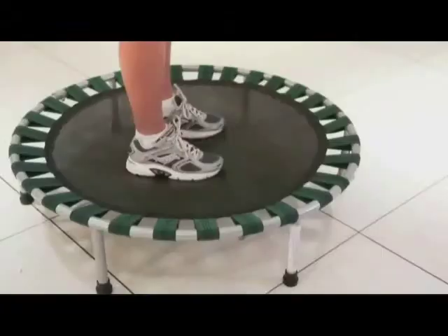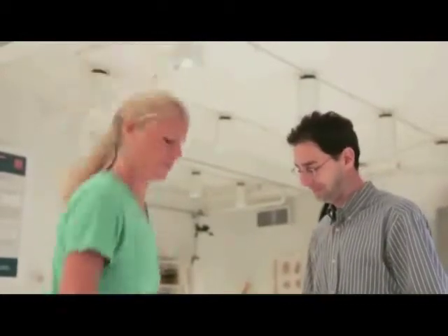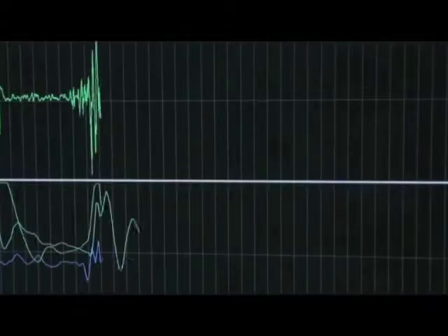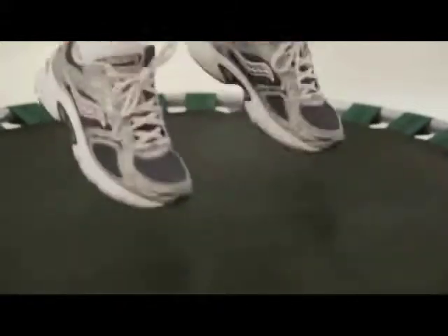Dr. Walker moves Monica to the trampoline and instructs her to jump a few times until she gets into a rhythm. The accelerometers are used to estimate foot contact and assess the muscle firing of the quads and other leg muscles. This technique reveals the timing characteristics of muscles with respect to the physical event of the heel strike. The Trinio EMG system generates no motion artifacts, even under high-impact conditions, due to the absence of wires and the high stability of the sensor.